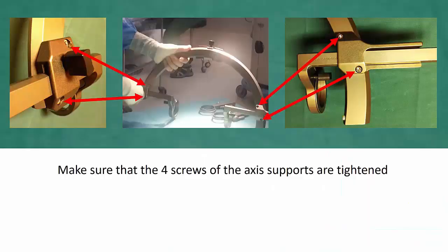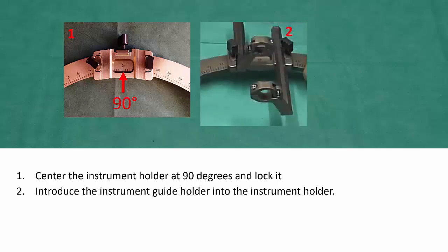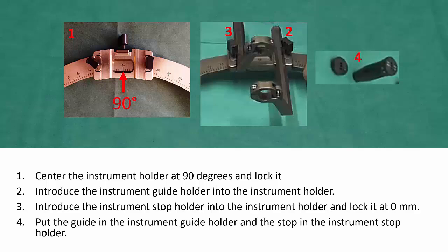We start preparing the arc by making sure that the four screws of the axis supports are tightened. We then center the instrument holder at 90 degrees and lock it. Introduce the instrument guide holder into the instrument holder and the instrument stop holder into the instrument holder and lock it at zero millimeters. Put the guide into the instrument guide holder and the stop in the instrument stop holder.